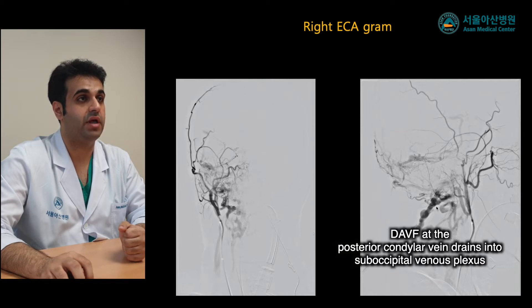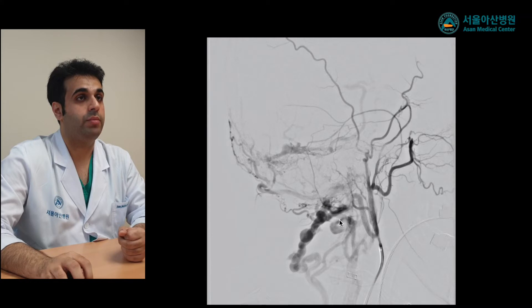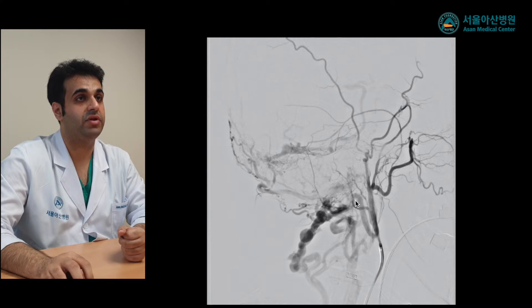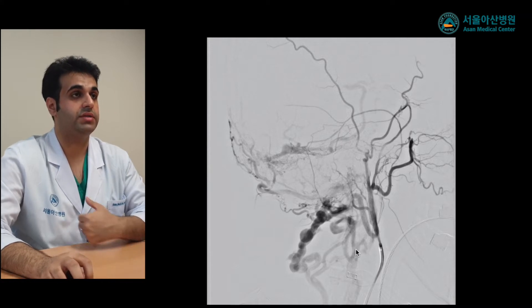Another dural AV fistula is located at the posterior condylar vein at the level of the skull base, which is supplied by the proximal occipital artery branches and ascending pharyngeal artery branches, with drainage through the suboccipital paravertebral venous plexus.